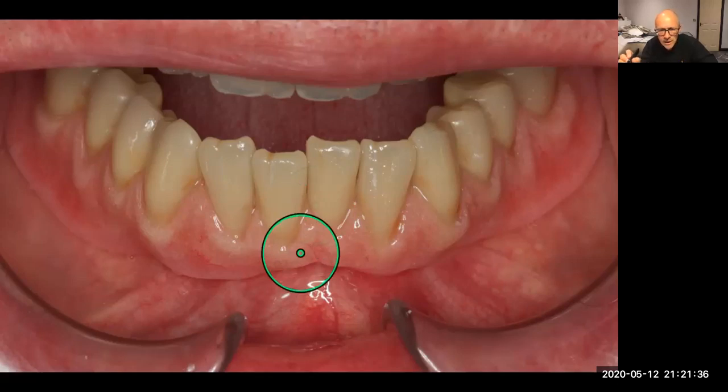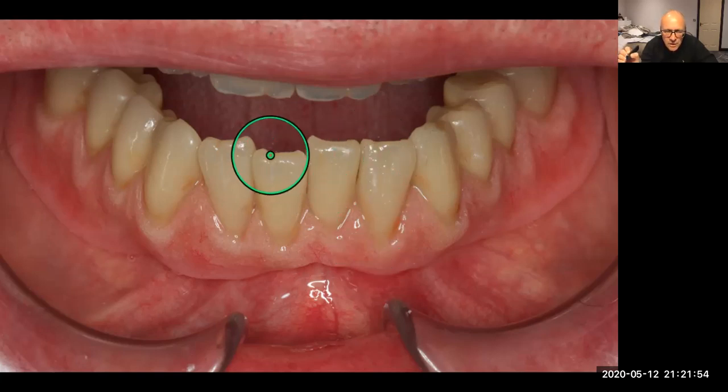So we've got this lovely border of these little bits of veining fibre, not very much, and then the lighter attached gingivae. And then once the denture's processed, that's when it gets characterised. So for instance, a really lovely detail is to make a little chip in the edge of a tooth and then a crack down it. That crack is created with a scalpel blade. The tooth is then sandblasted with aluminium oxide. And then white composite is placed in there, and then a little bit of staining just on the top there. Really important.